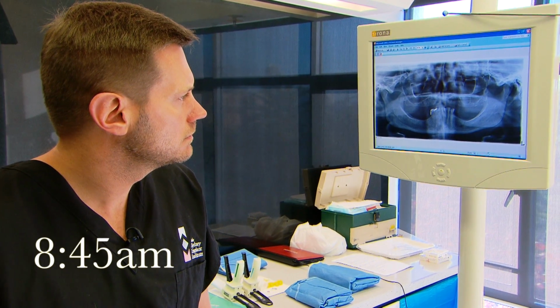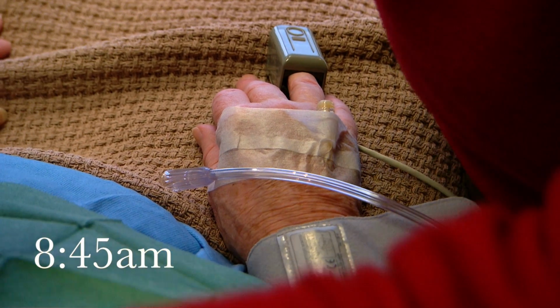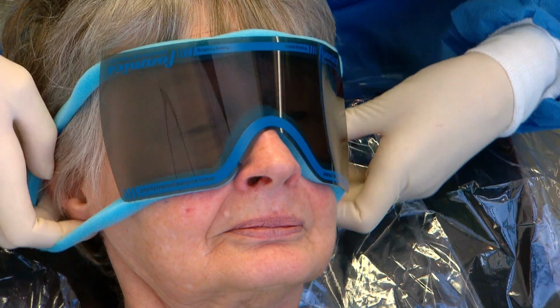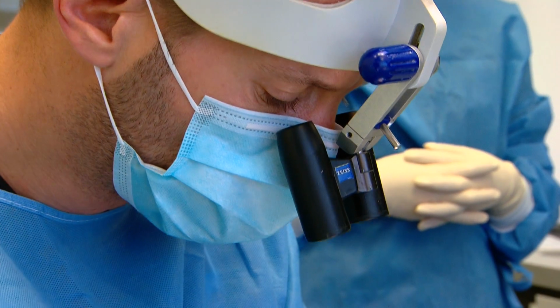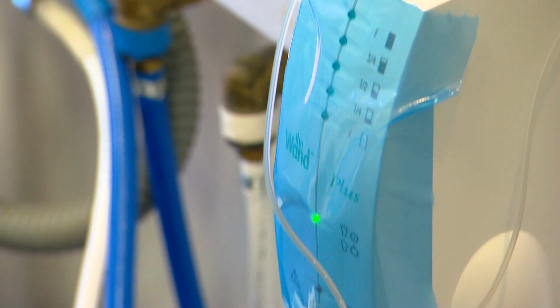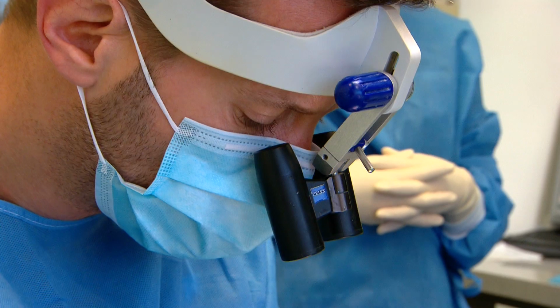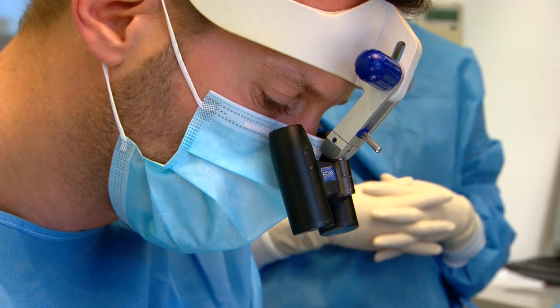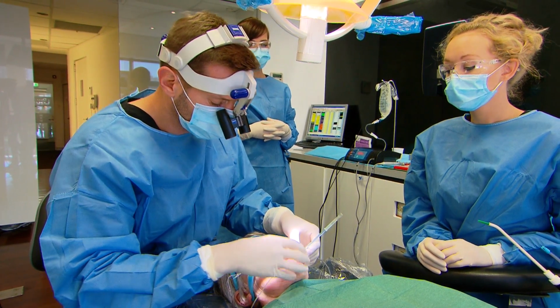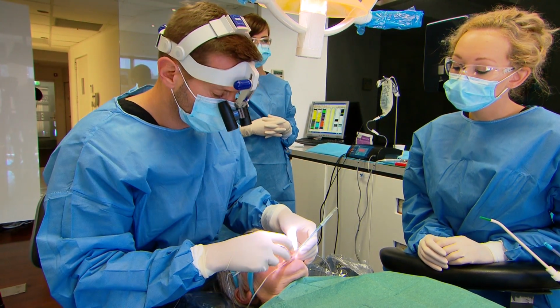Twilight sedation is a conscious sedation where the patient is relaxed, comfortable, able to respond, but not bothered by the surgery that's going on. So initially we use a local anaesthetic called articaine. We use a machine called the wand, which is a computer-assisted anaesthetic delivery system, which means that these injections are really painless. We make it all numb first, and then I use a longer acting anaesthetic, which lasts 7 to 8 hours.